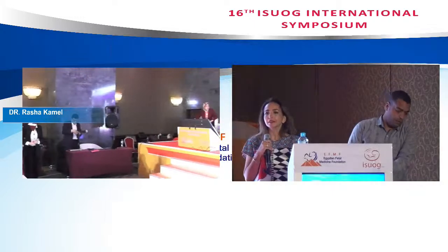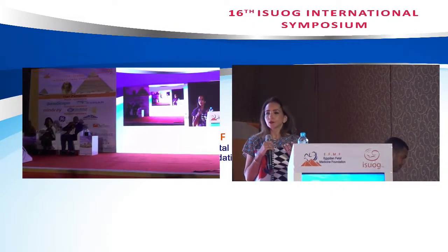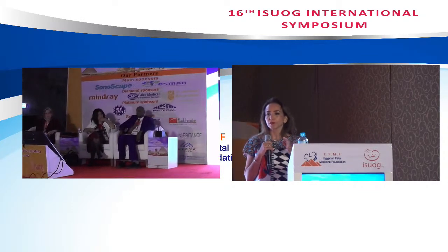This is a very important question. The additional benefit of ultrasound is the benefit that we always acquire from ultrasound in addition to clinical examination. Ultrasound is very objective. If you are in doubt about something, you do the ultrasound, you measure what you see, it's very objective.